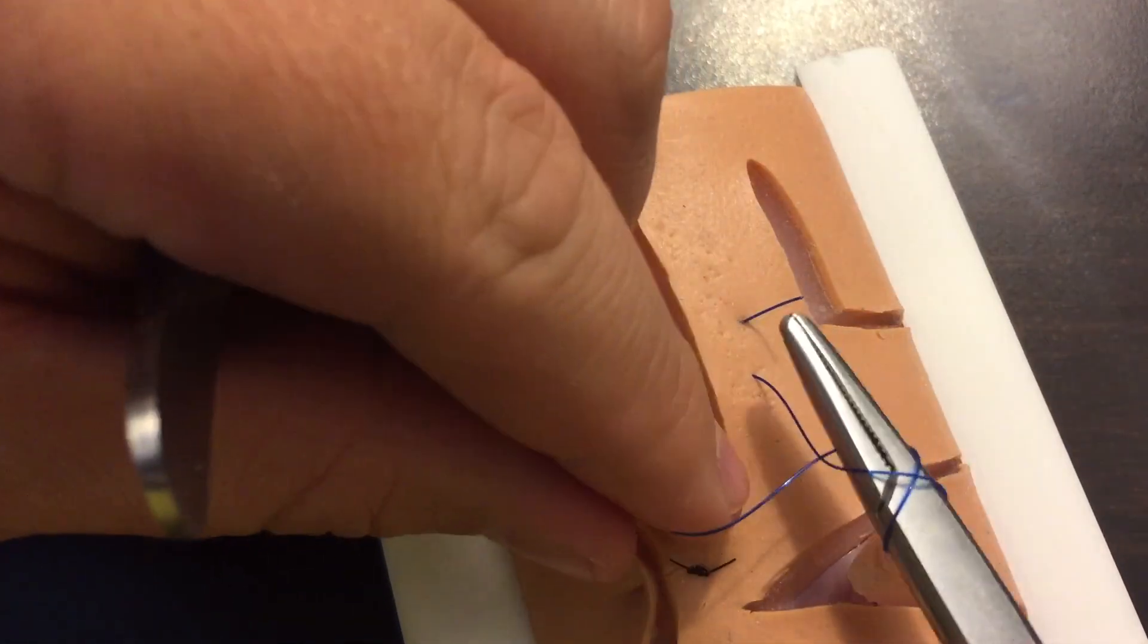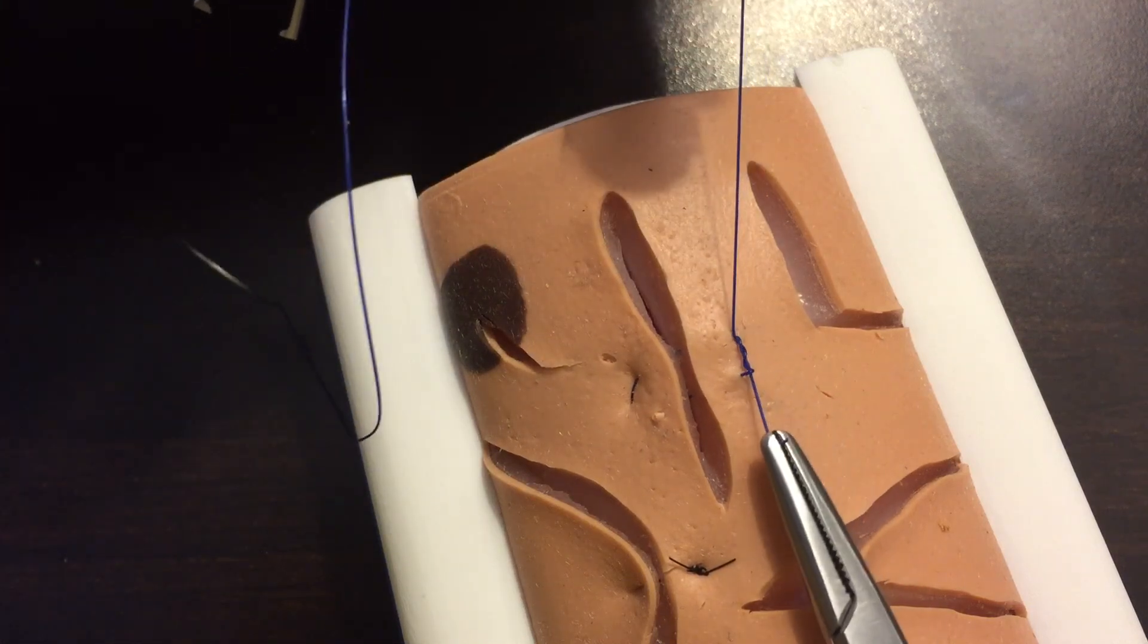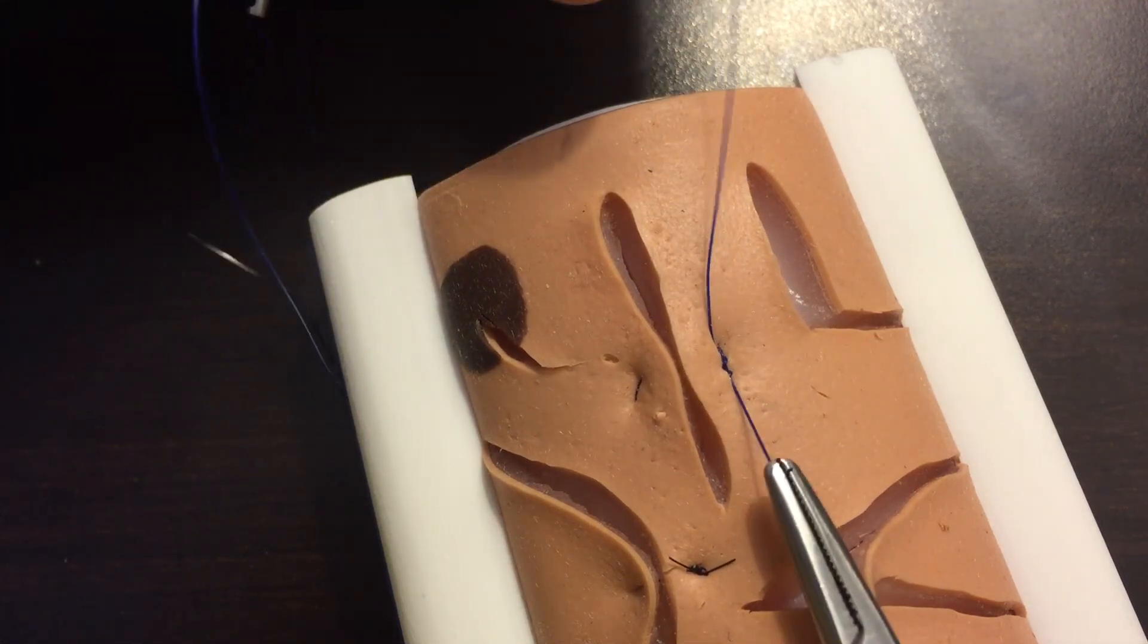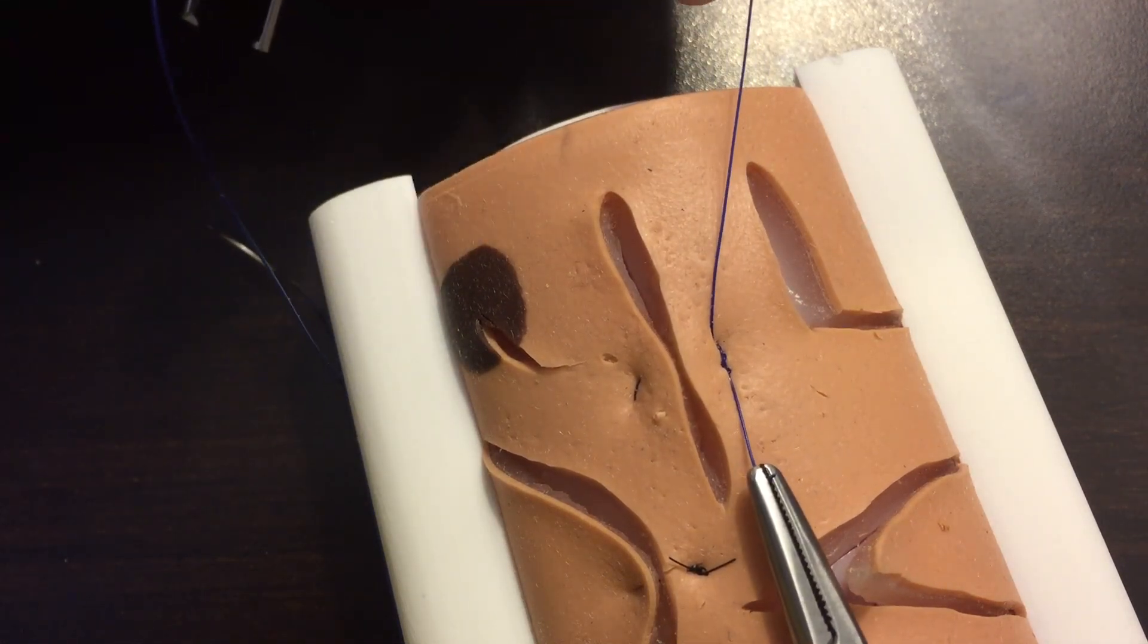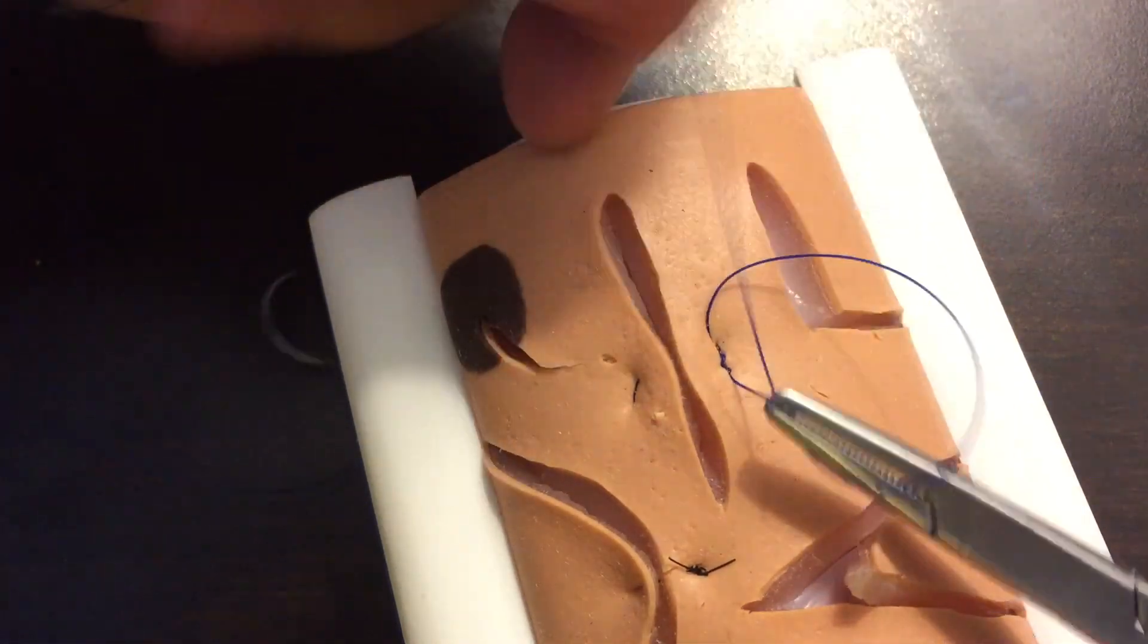Now we're going to use our needle driver to do an instrument tie. You can see that when we do this, it's going to pull the skin edges close together. It does a good job approximating the skin edges and everting the skin edges.